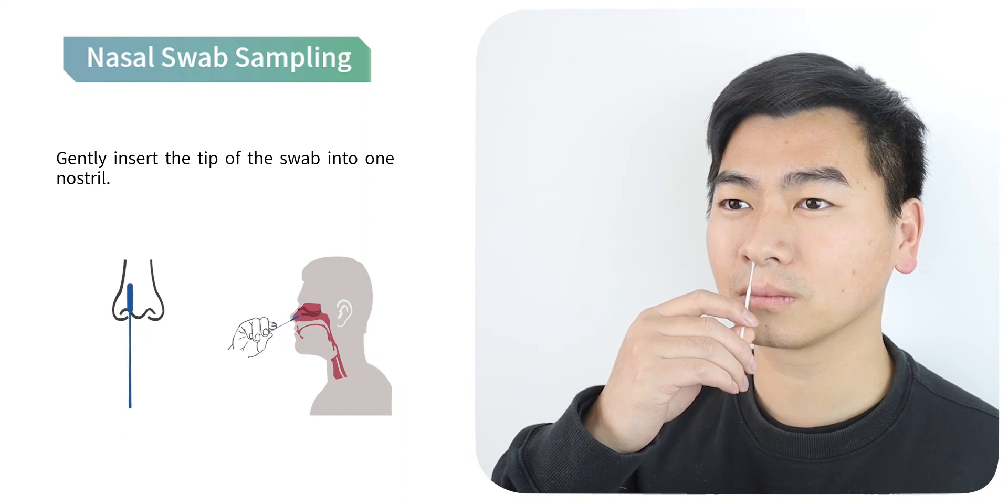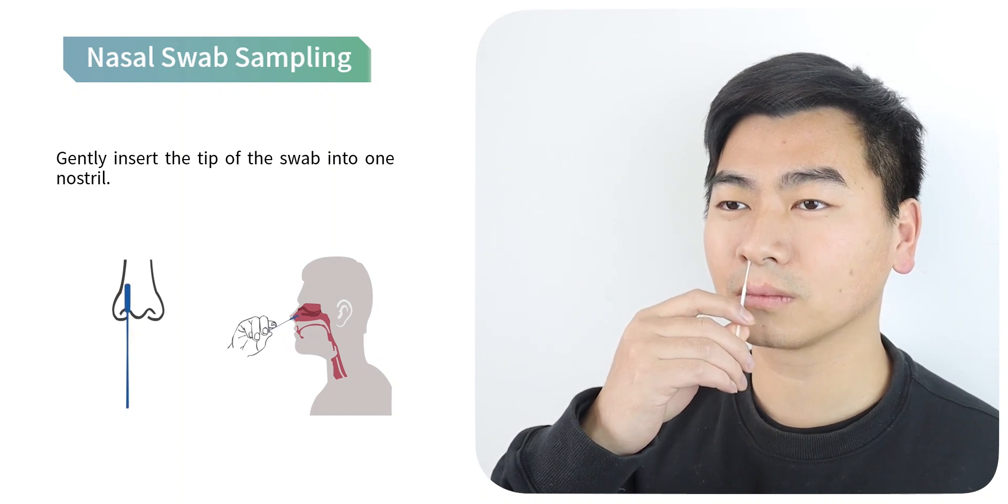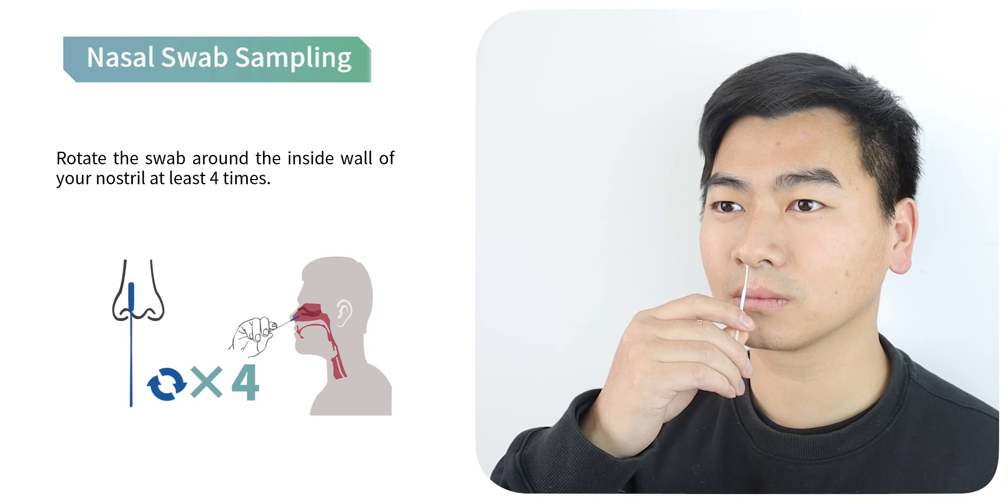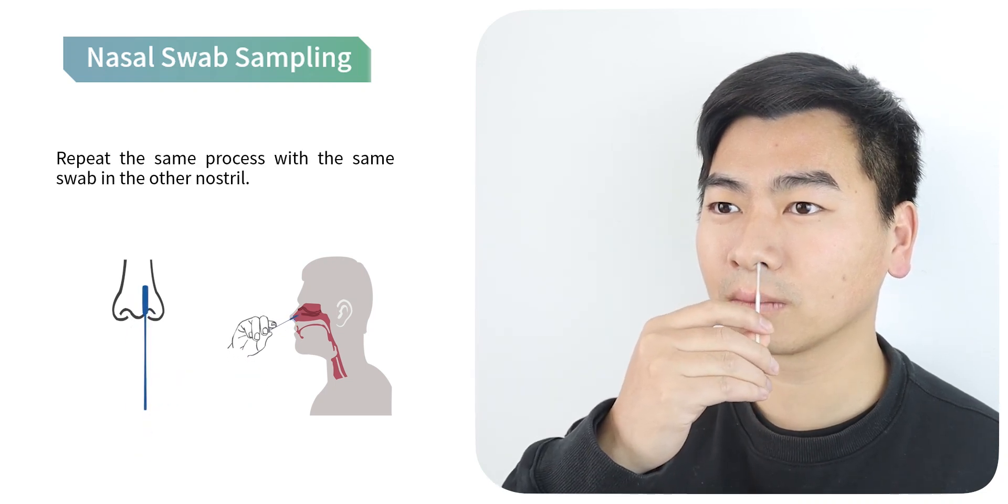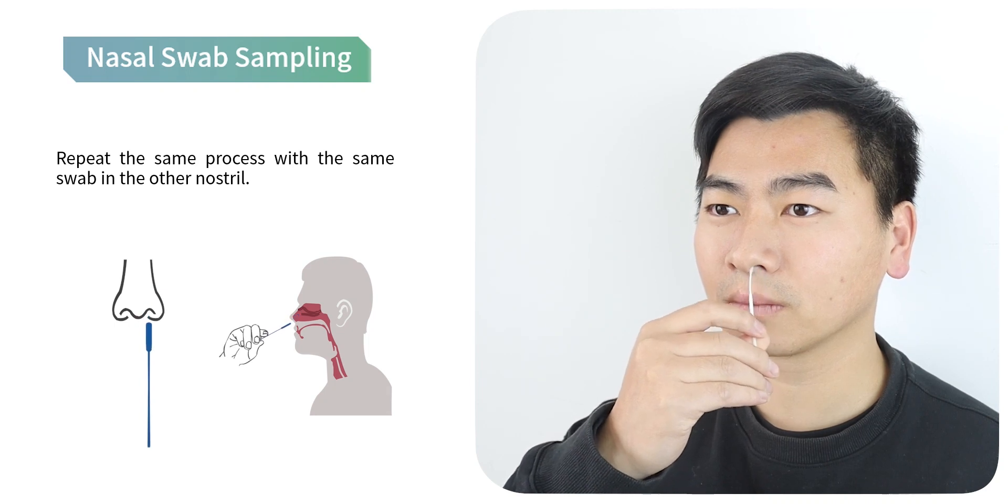Nasal swab sampling: gently insert the tip of the swab into one nostril, rotate the swab around the inside wall of your nostril at least 4 times, then repeat the same process with the same swab in the other nostril.